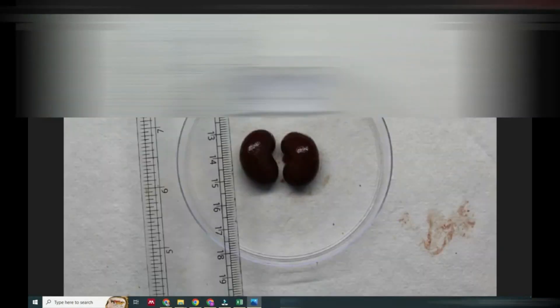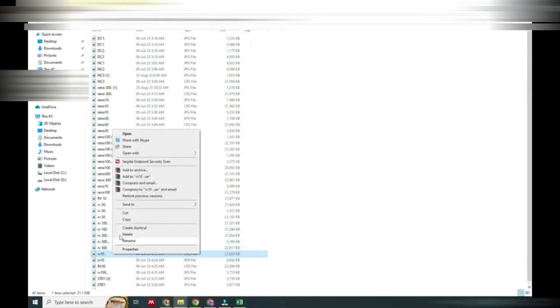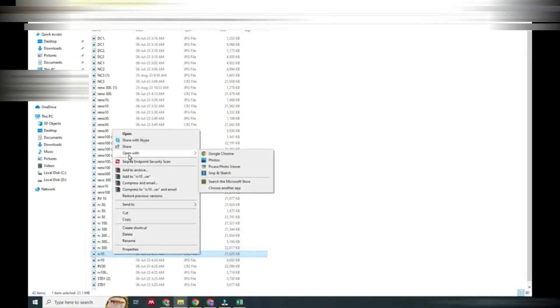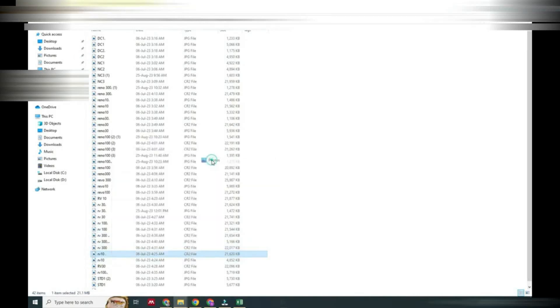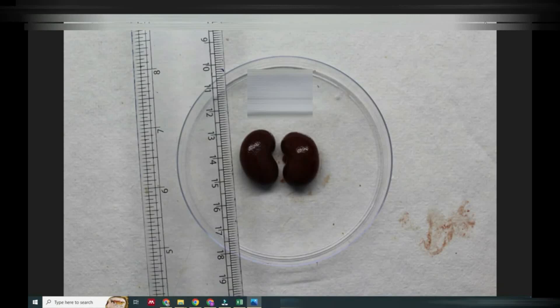It is a CR2 file so it takes time to open, and sometimes in Windows it does not easily open. But now you can see it is open.